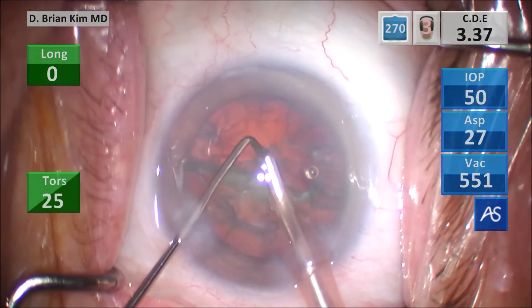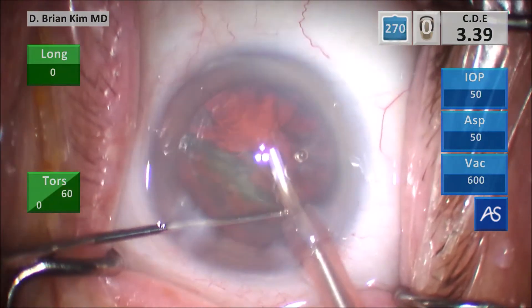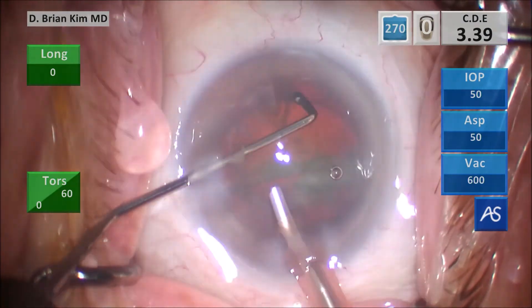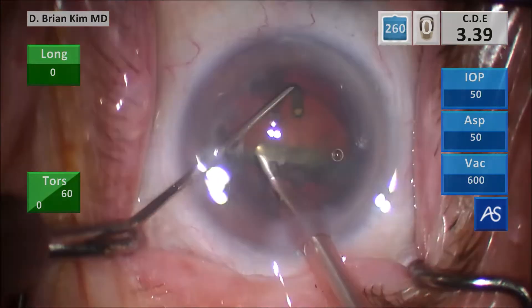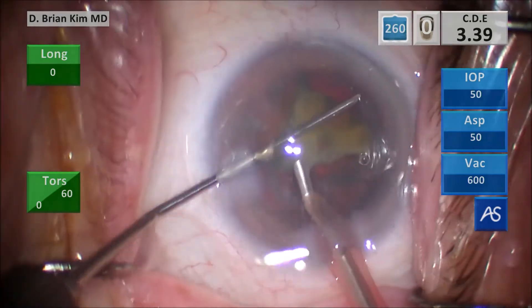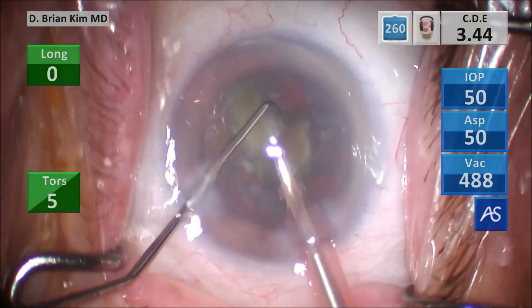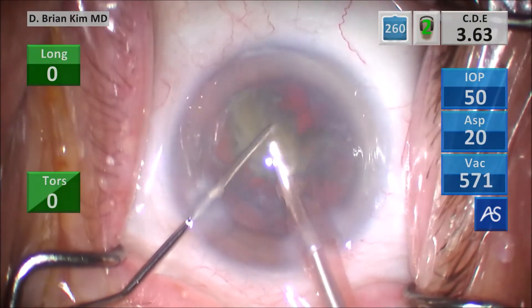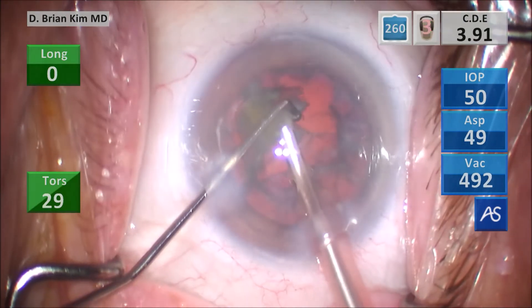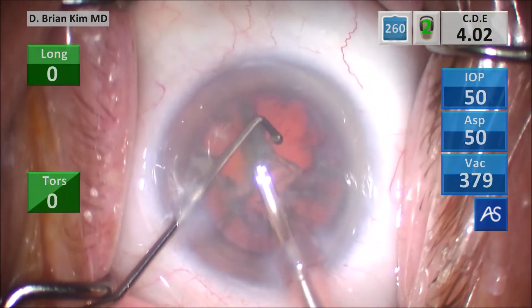So that first heminucleus is out. I'm going to rotate the second heminucleus in front of me. Since the lens is out, it's again loose in the bag — no zonular traction with that. You place the chopper around the heminucleus, pulling it central toward the phaco tip, fracturing the lens in half, doing the same maneuver around that third quadrant, getting that chopper, hooking it around the lens equator, bringing it towards the phaco tip, and crushing the lens in half again. Using successive crushing forces to break the piece into smaller and smaller pieces, then emulsifying the lens piece.